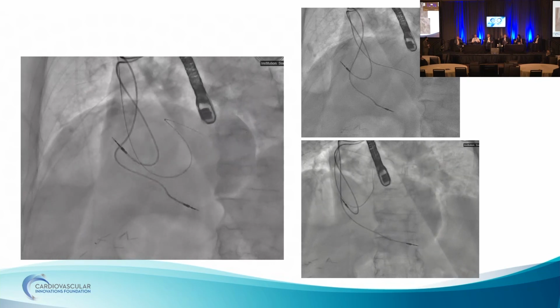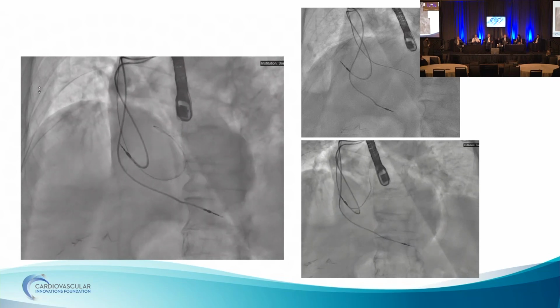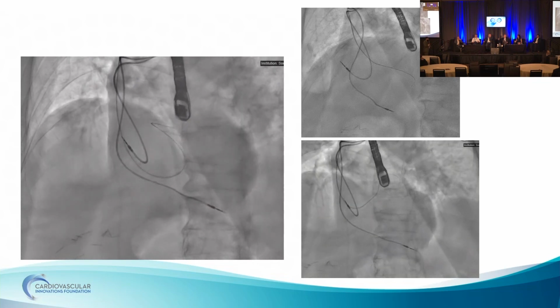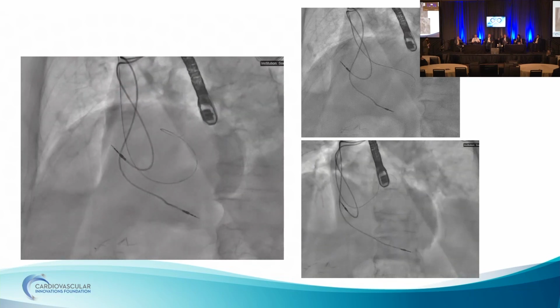But I don't know if you thought it was really stenotic or if it was just kind of a weird shape. Yeah, no, I didn't think it was actually stenotic. Once again, I was able to get the glide cath across, but couldn't get a stiff catheter or a stiff wire just because everything would just prolapse out. But agreed, it was more catheter manipulation that was difficult.